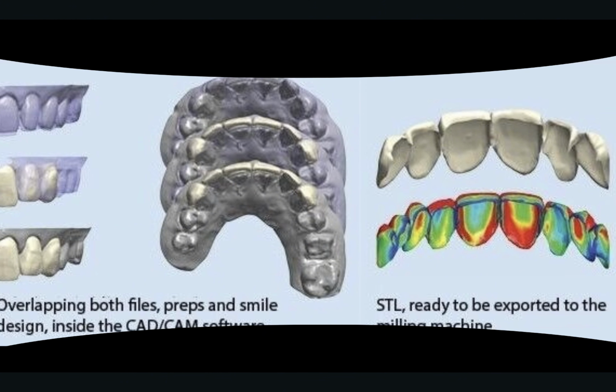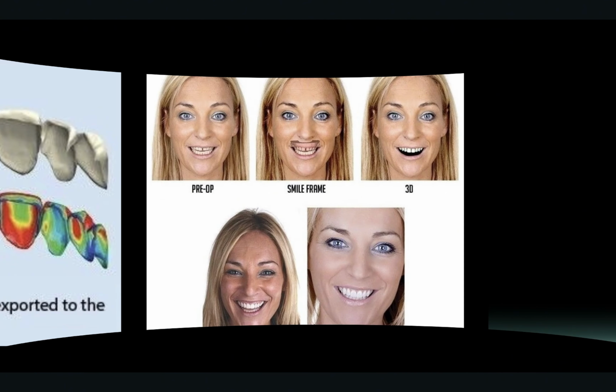More and more data being added, developed, revolutionized, where all of these things converged to be able to have this digital workflow where we changed 2D or 3D into 2D, back to 3D, and do it in a way that's reproducible and predictable. And the best part about it was that you could show the patient from the start, physically inside their mouth, where they would end up when they finished.